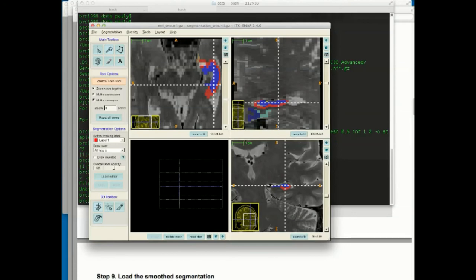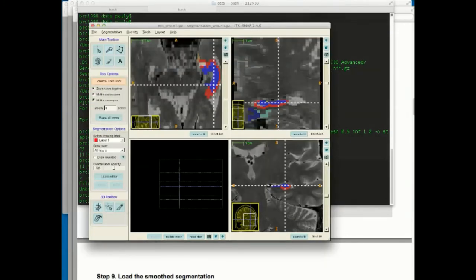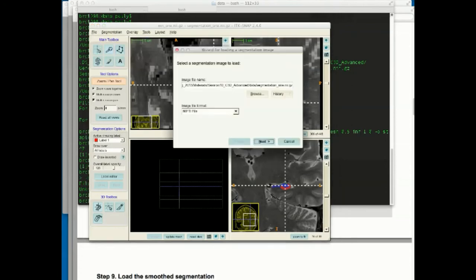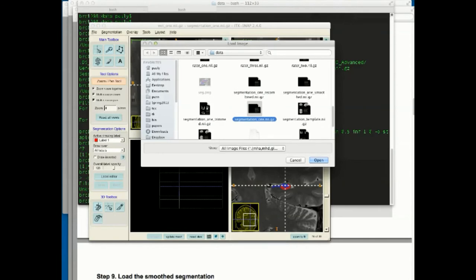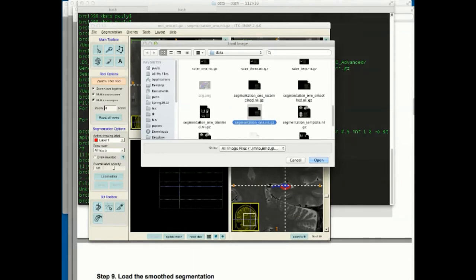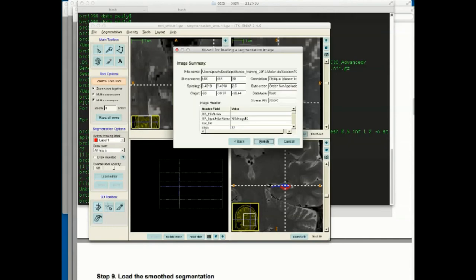Whereas in vote, it has no such information. You're just loading 10 image files, and so it's going to assume they are numbered serially from 1 to 10. So after voting, what you're going to get is labels that are 1 to 10. Let's load that. Recombine. You're going to see some colors change.